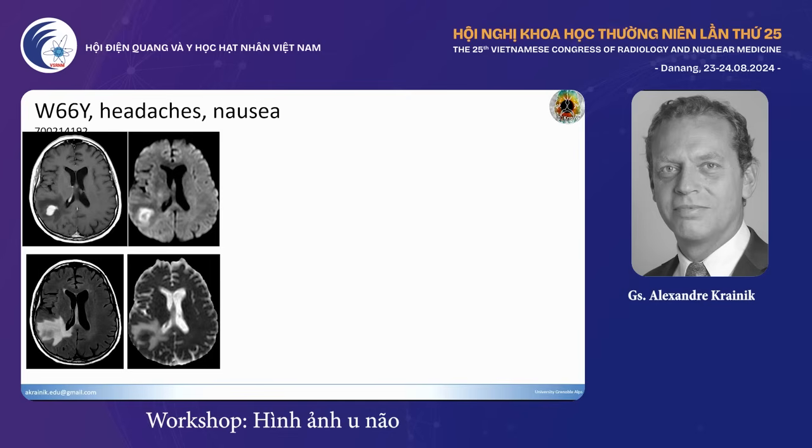One reason, which is quite common, is when you have a stroke, the cell inflates because of the cytotoxic edema, then the water molecules have problems moving around these big cells, okay? And the other cause for an impairment in the movement of these water molecules is when there are too many cells, when you have hypercellularity, okay?